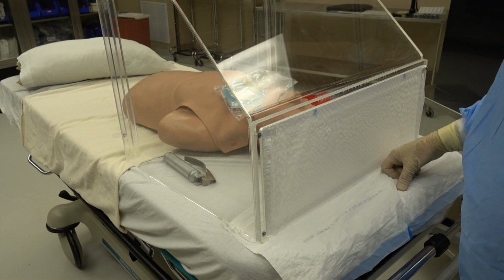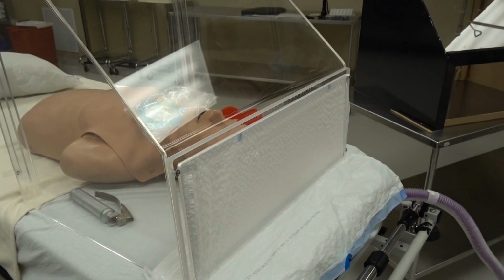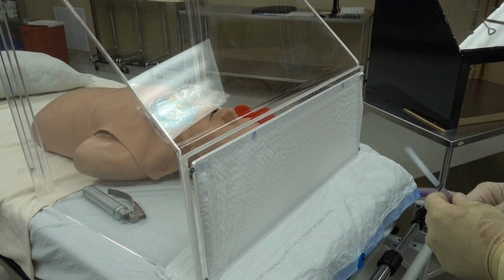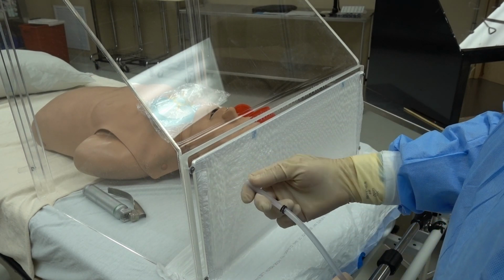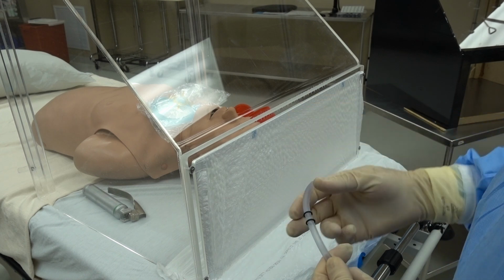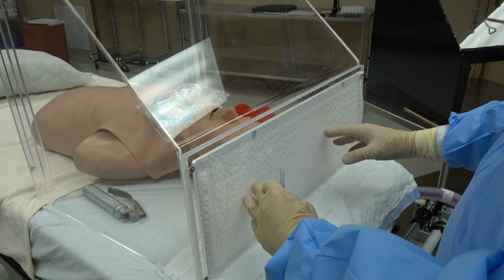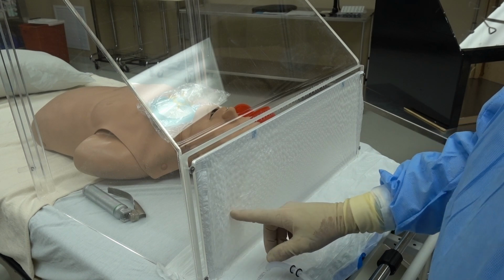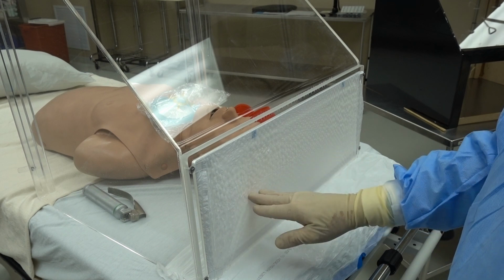Now the first thing we'll do is, let me make sure you can see where we're going. We'll place the vacuum in, and you'd like to cut this as short as you can, cut the end up, make it kind of short and sharp like a trocar. It has 2 O-rings on it, and we've used this over and over, but it's quite easy to do. You need to make a penetration wherever you want your ports and where you want anything to go in there. You need to make a circular opening, and probably an 8.5 corneal trephine would be the best for your hand or fingers.